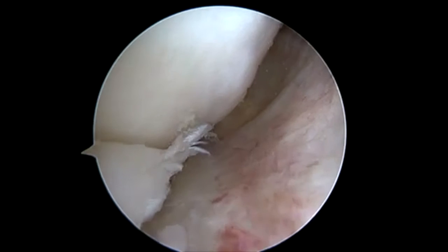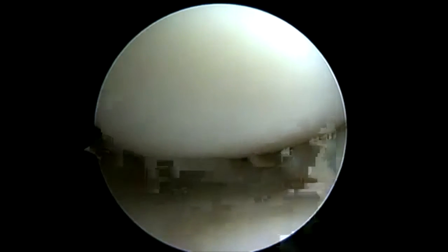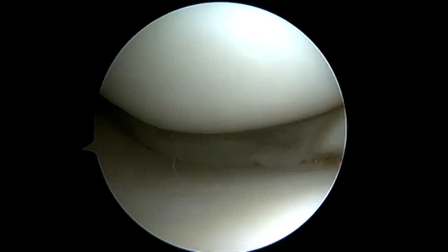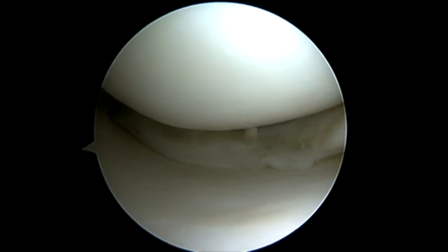You can see our nice split in the meniscus here. As we lever on the leg and trephinate the medial collateral, this will open up our joint space. I just do it sequentially enough to allow me to insert the device and no more.